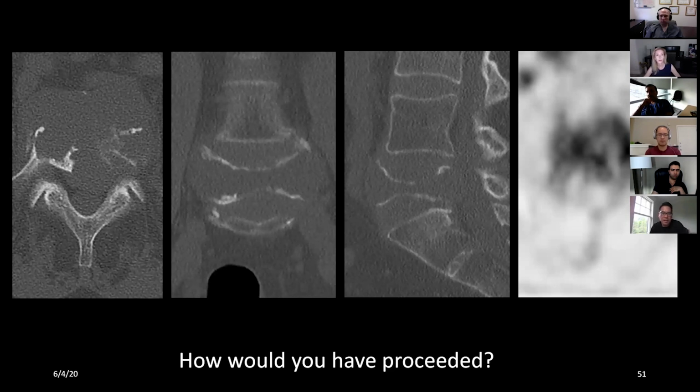I think this is tough. It's also the morphology of that L5 vertebral body. It's so flat in the middle. Even if you fill the entire cavity with cement, I don't know how much load-bearing capacity that's going to give that patient. But then again, an anterior column reconstruction surgically here is also not trivial, either through an anterior or lateral approach, especially with the poor bone quality that you can see there on the CT scan. So I'm curious if you have some innovative ideas.